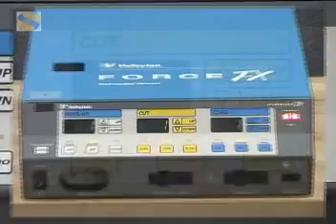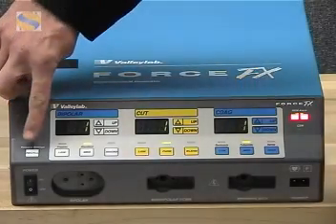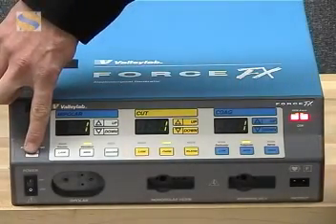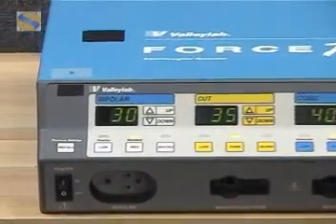Once the generator has completed a successful self-test, it defaults to a power setting of 1 watt for all diathermy modes. However, using the recall button on the left side of the front panel, the previous settings can be quickly recalled. This is useful in emergency situations when setup time may be limited.